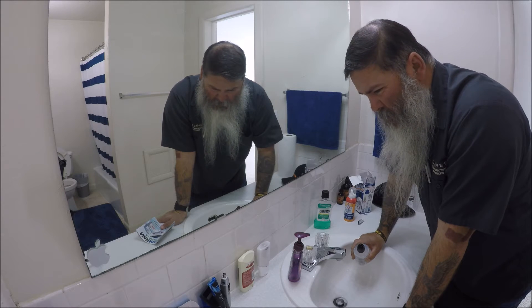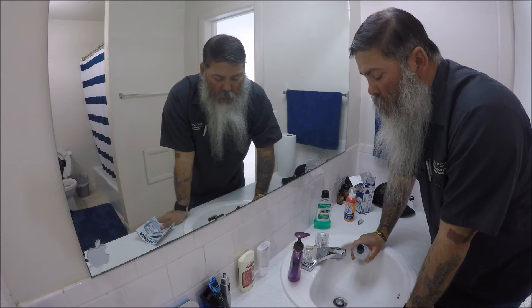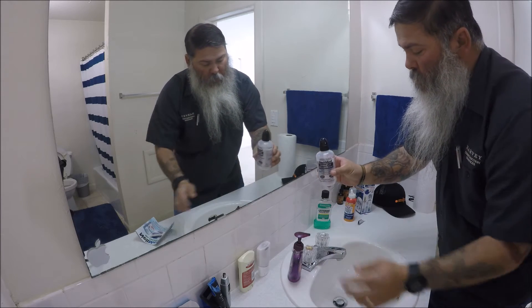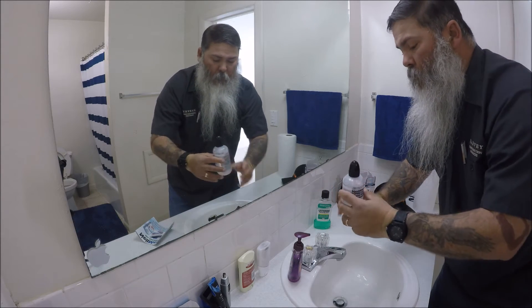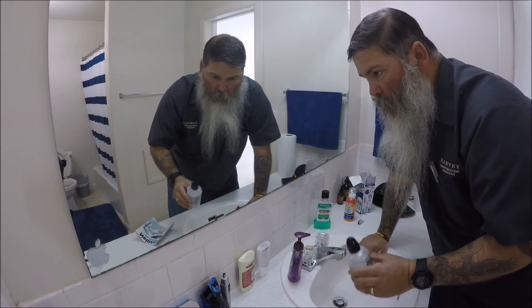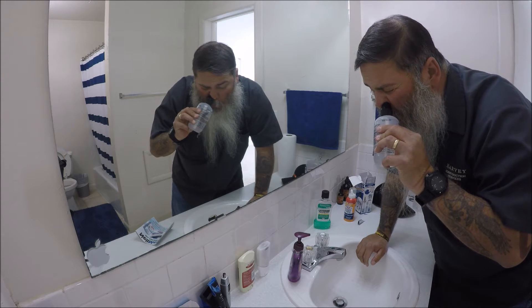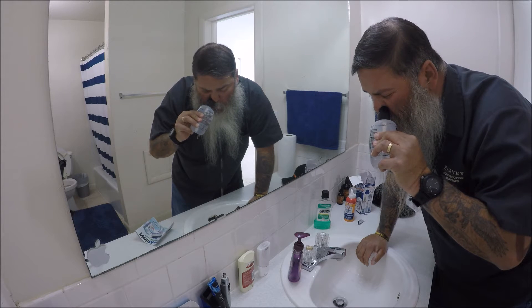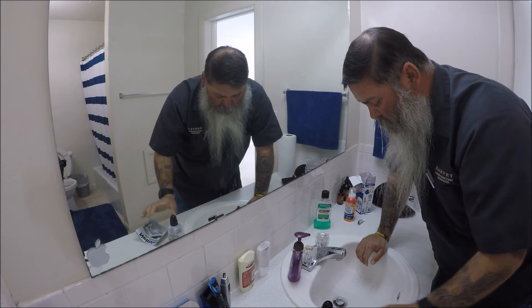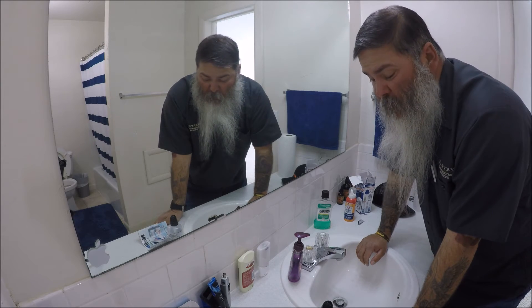I'm glad my cleaning lady's not coming till next Thursday. Still got it — alright, we'll use one more of this. Here we go. I think I sucked some of it back in the bottle — I don't think it's supposed to do that.